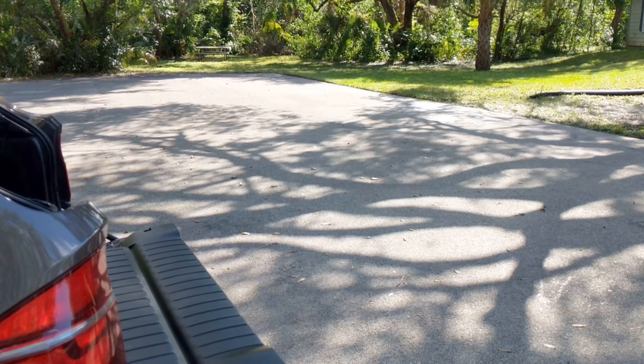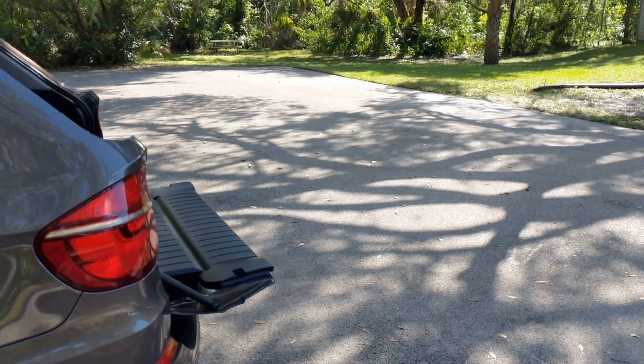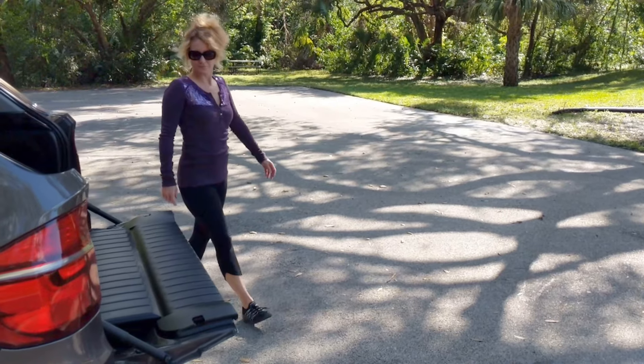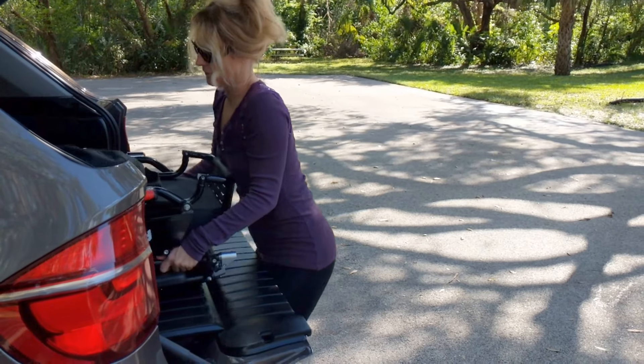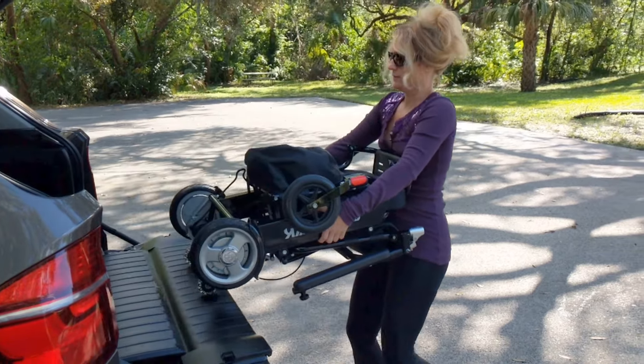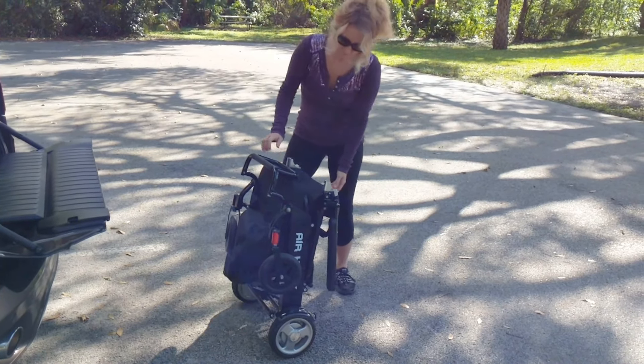In this video we're going to show you how even a petite female can easily unload the Airhawk power folding wheelchair. There we go, very easily taking it out of the back of a sport utility vehicle.